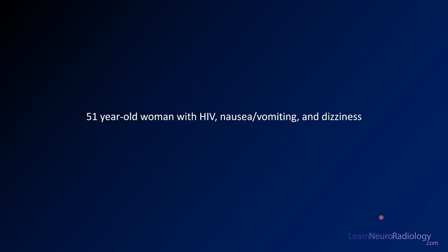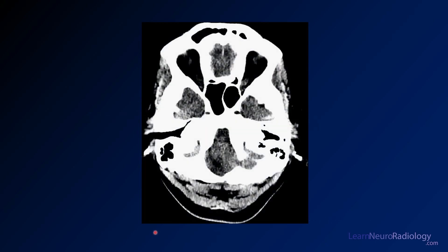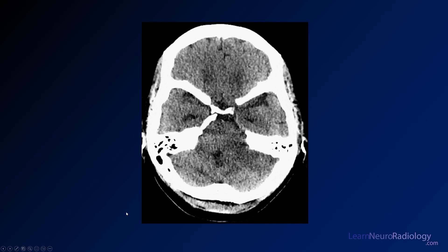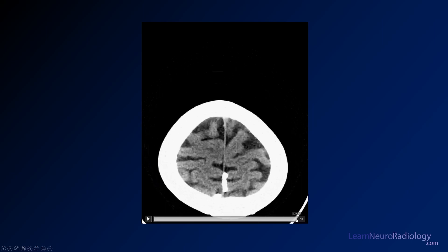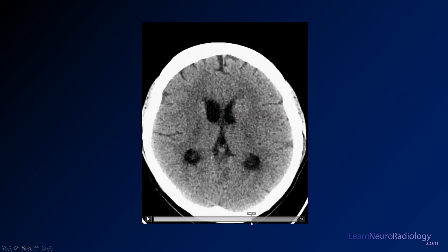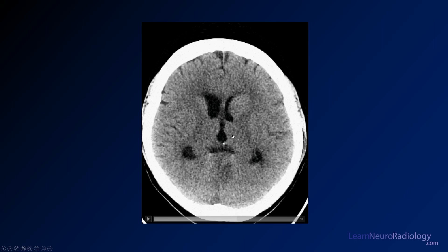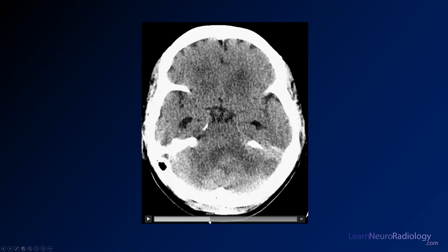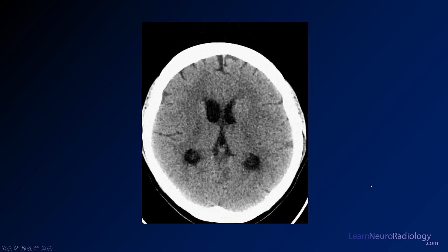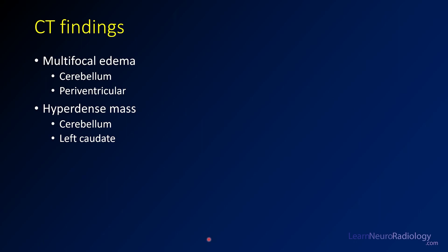This next case is a 51-year-old woman with HIV, nausea, vomiting, and dizziness. Looking at the CT: the supratentorial brain looks okay, though maybe there's some asymmetry of the caudates. The real finding is in the posterior fossa, which looks really swollen and full — maybe some hyperdensity there. Something seems to be going on in the right middle cerebellar peduncle. The cerebellum looks pretty swollen. On representative slices, there may be hyperdensity with multiple masses in the cerebellum, and the caudate looks a little funny. We have multifocal edema, some periventricular edema, and some cerebellar edema, with possibly hyperdense masses.